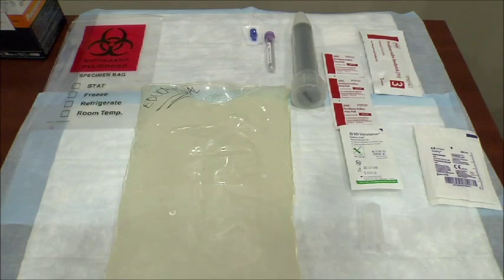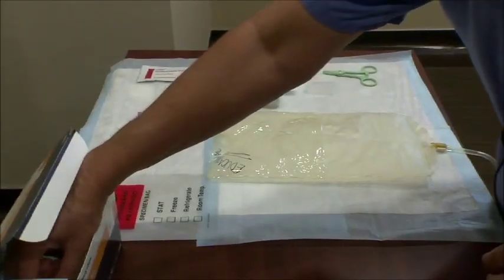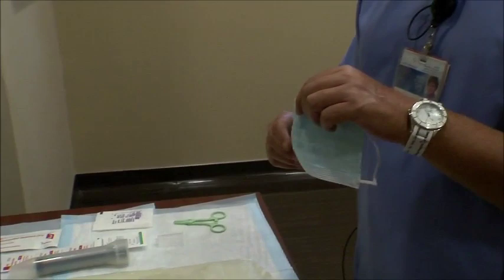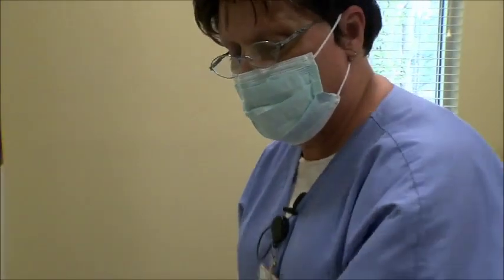After gathering our supplies, we need to wash our hands. But before we wash our hands, we need to mask. We use a mask. We then rewash our hands because we've contaminated when we put our mask on. So then we glove.